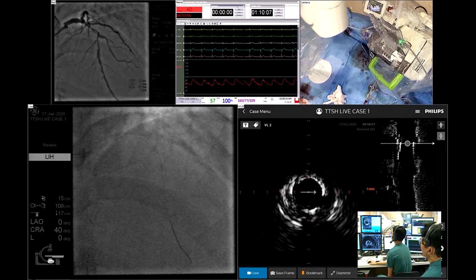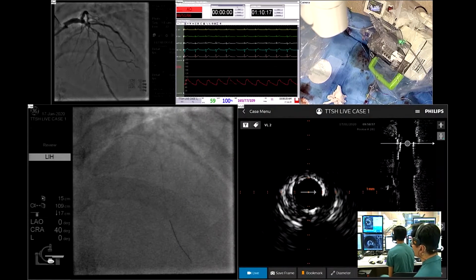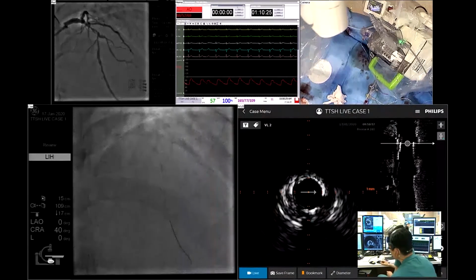That's all. Okay. I was asking about the IVUS auto pullback, because if you do the IVUS auto pullback, you can potentially measure the lesion length. Yeah. But theoretically, you don't have to, because you come back one mm per run, so you can actually have. Tony, can we see?